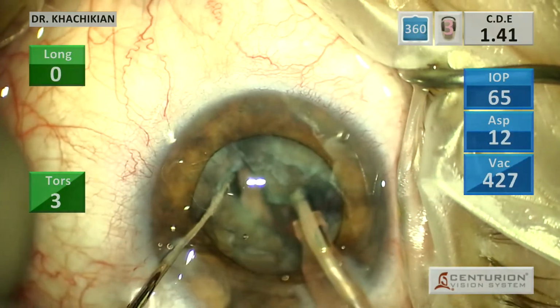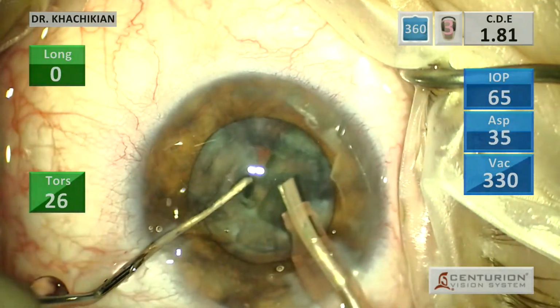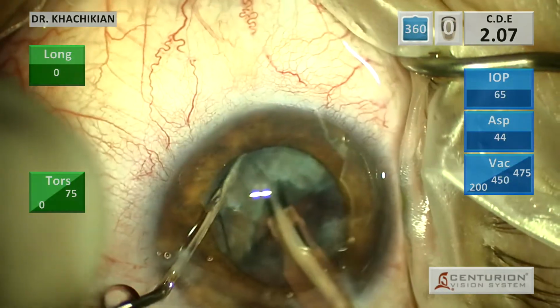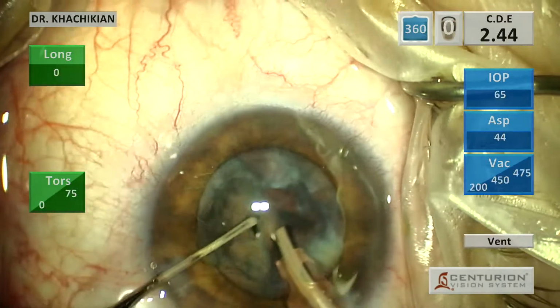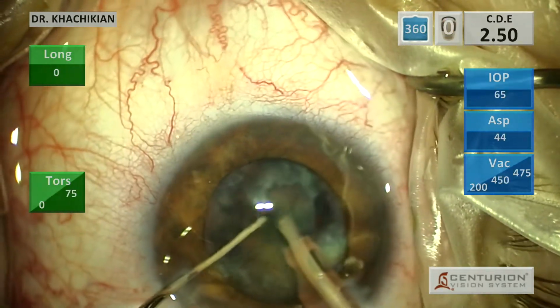If you're in foot position 2, or 1 I should say, and you try and place the second instrument behind the lens, sometimes it's a little too tight. There's a little too much pressure in the anterior chamber. And so I usually will go into foot position 0 and then manually place the chopper behind the lens equator.